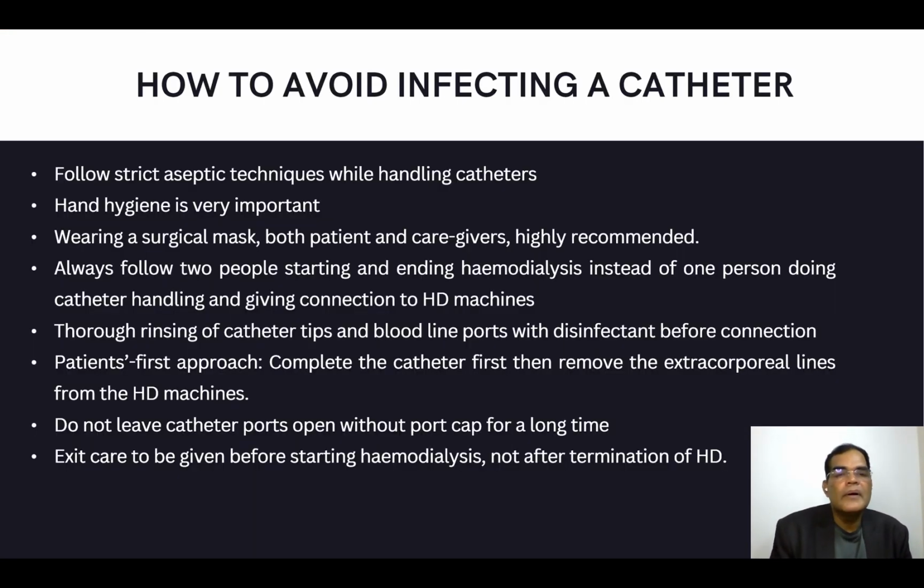Again, if you look into how to minimize or avoid infection in a catheter, we have to follow the aseptic techniques which I mentioned earlier. Hand hygiene is very, very important, and wearing a mask both by patient and caregiver is recommended.